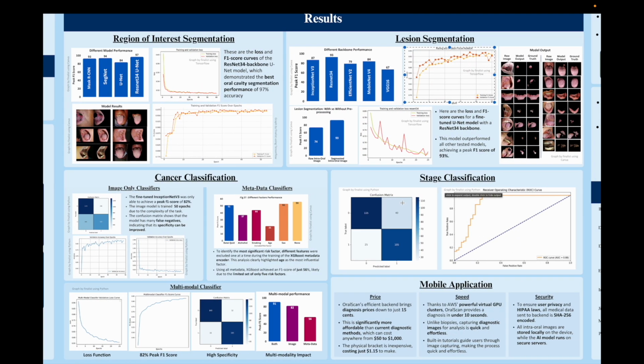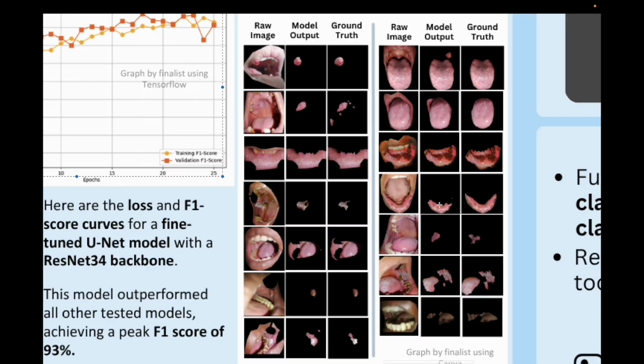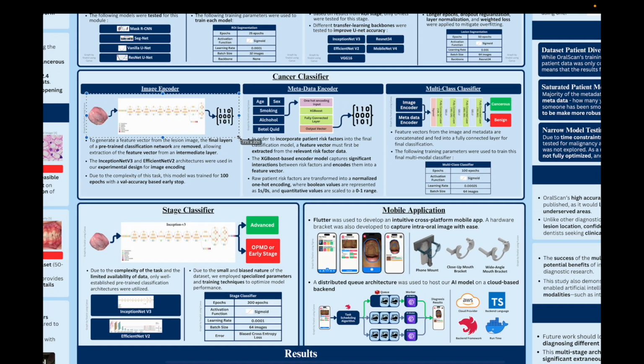As you can see on this result board, here's the performance breakdown for oral cavity models, and here are the results for the abnormal lesion classification model. The final stage of this architecture handles classification. The first multimodal classifier extracts a feature vector from the lesion image using a decapitated and fine-tuned Inception v3 model.